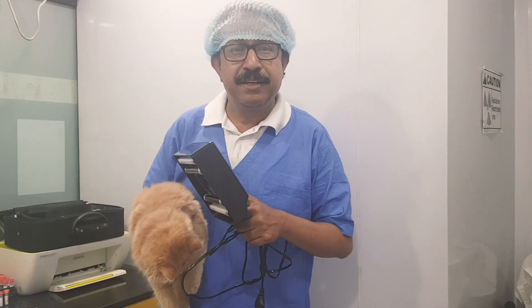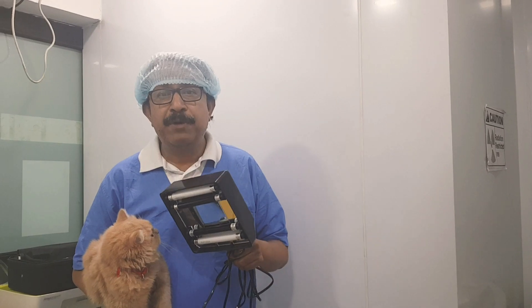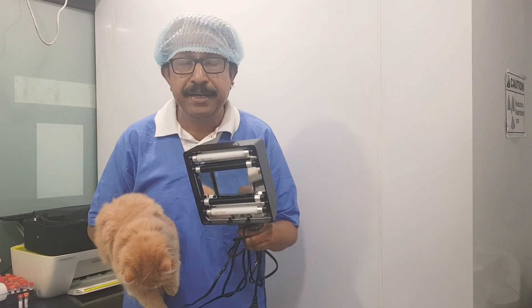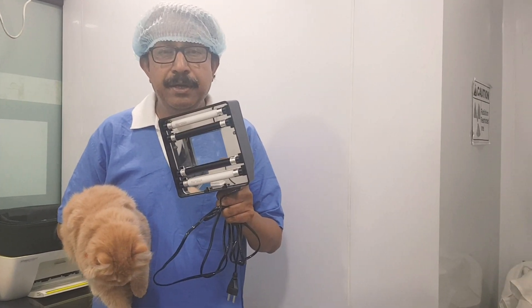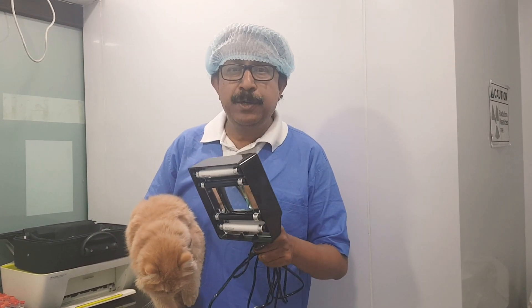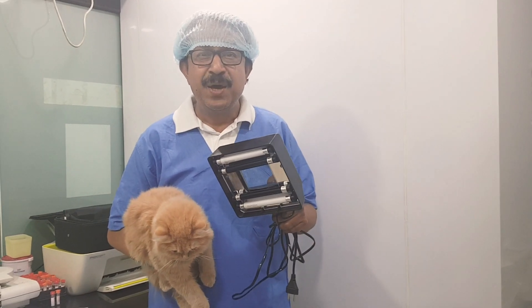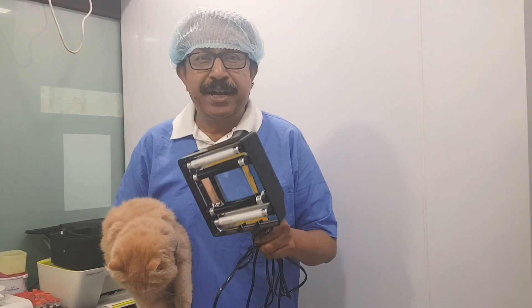The glowing hairs should be cultured to confirm the infection, as the Woods lamp is not 100% definitive. For full confirmation, we have to culture the glowing hairs. This can also be misleading, but for 99% of cases it is accurate. To confirm, we also use our microscope.